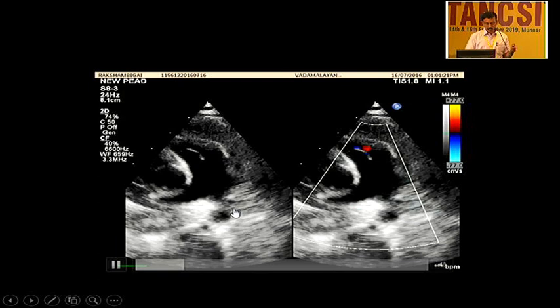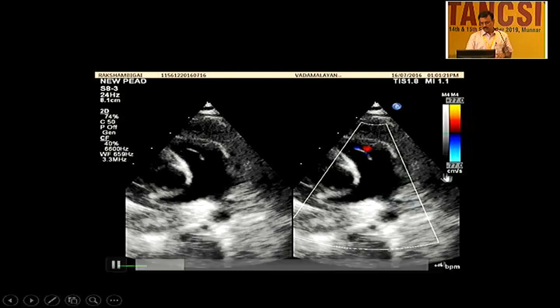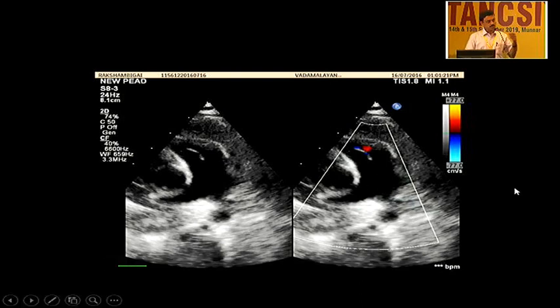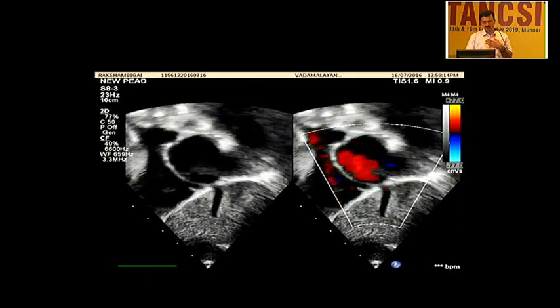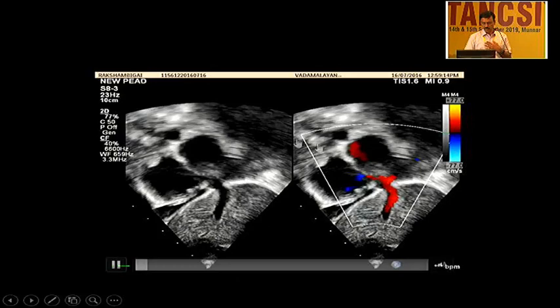Clinically, I have diagnosed tetralogy of Fallot. Clinically, there is a good ejection murmur, but I have not been able to show where the stenosis is. And I also have not shown from where these individual great arteries are coming. So for this reason, as we have been repeatedly telling, one should practice the subcostal view. So this is our starting view, the subcostal view.